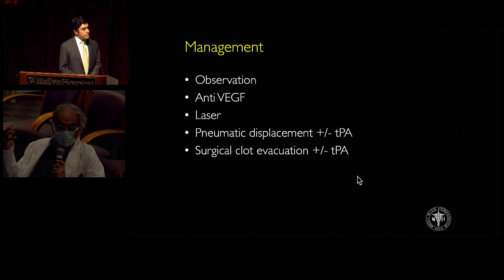So you don't need to treat directly on it, as my colleagues are saying, but rather around it, because there'll be enough heat that will go in. You just have to tickle around it, basically. There'll be enough heat around it in this chaotic, turbulent flow system to cause some thrombosis in the wall, and that's all you need.